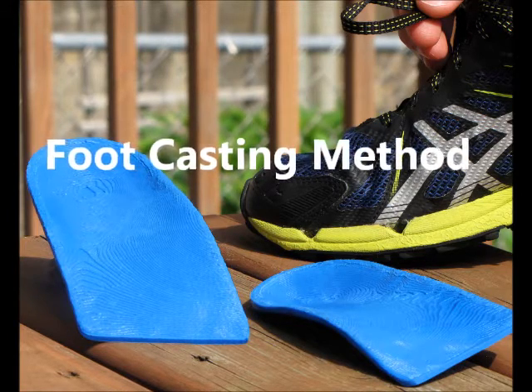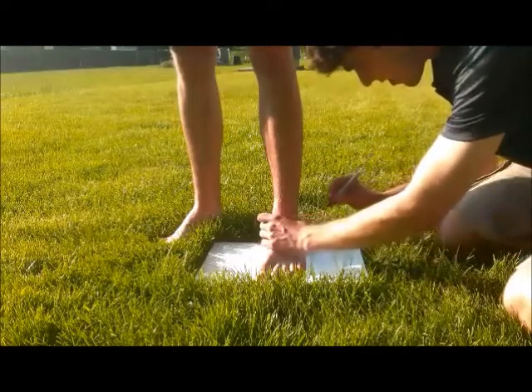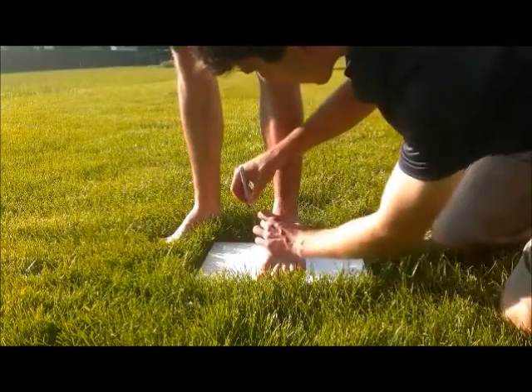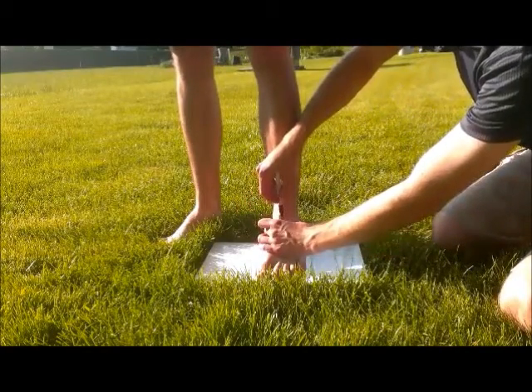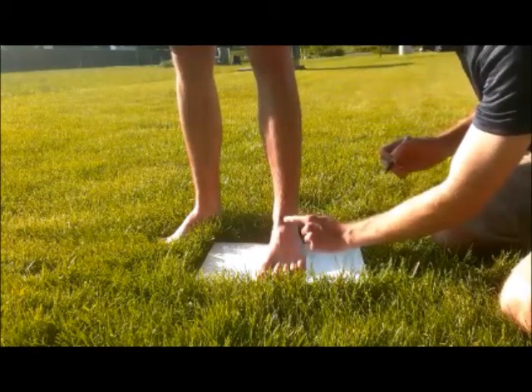Step one: mark the key reference points. The first two are the talonavicular reference points. Simply feel for these by running your fingers along each side of your foot. You'll find a little indentation which is indicative of this joint. Bisect these two reference points.